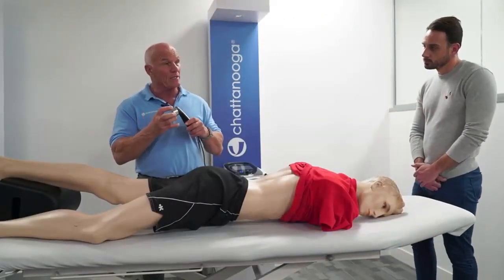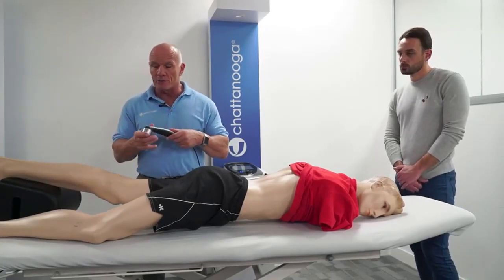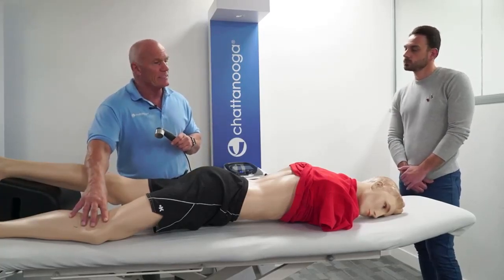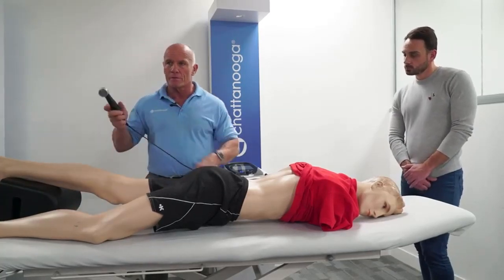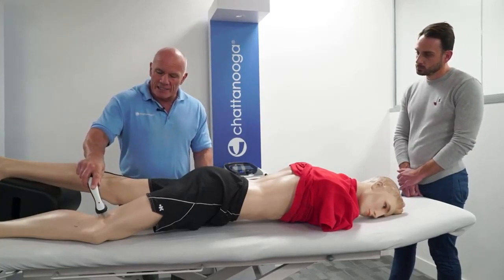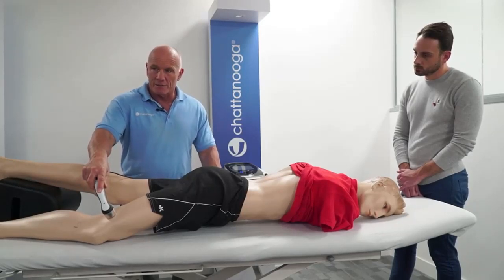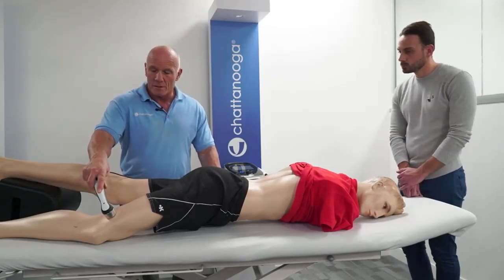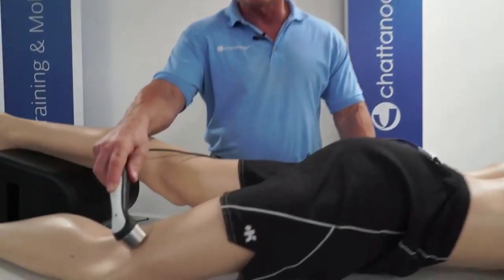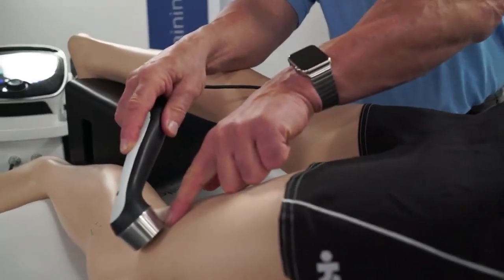So just like we did with radial pressure wave, we're going to use a water-based gel medium, and we need to keep our head perpendicular to the tissue. Anything more than 15 degrees of angle will cause the sound waves to bounce off and not penetrate the tissue.